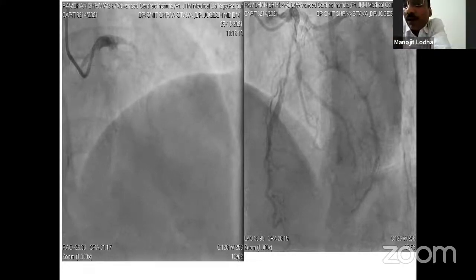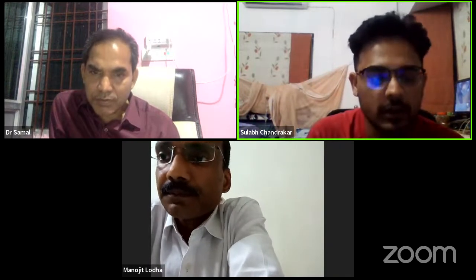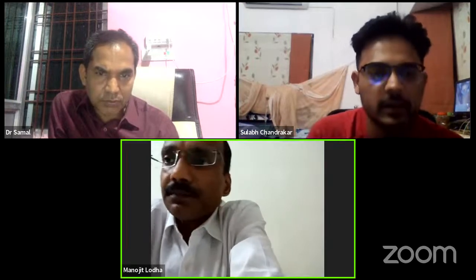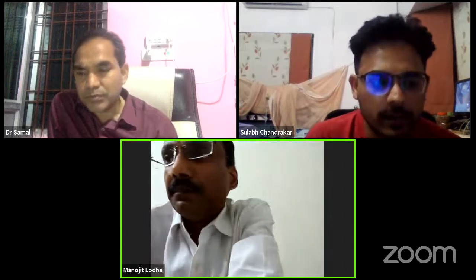And what was your catheter size? 8 French I took, sir. Sir, I took a USG guided puncture because I did not have any closure devices, so I called a radiologist. And the patient was a reformed smoker, and he was not willing for CABG. Excellently done. Thank you.